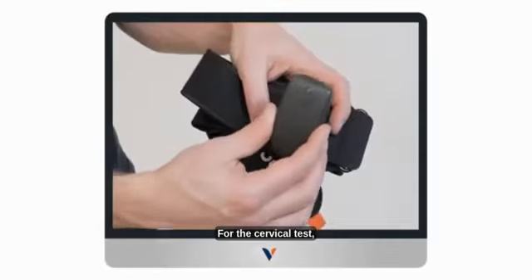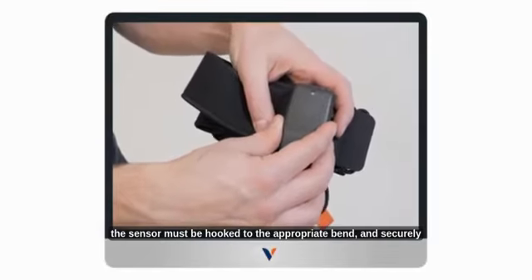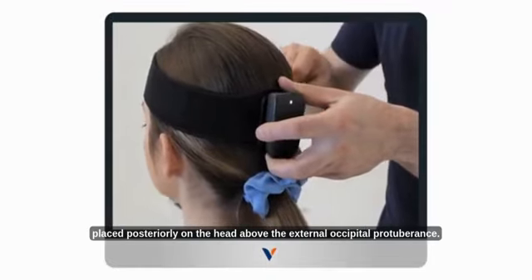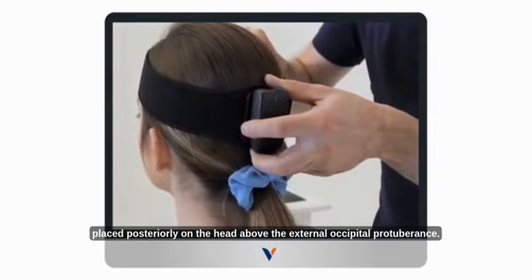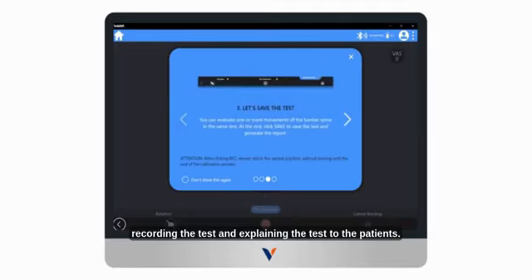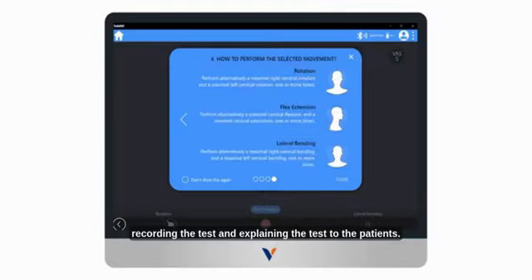For the cervical test, the sensor must be hooked to the appropriate band, securely placed posteriorly on the head above the external occipital protuberance. The pop-ups also guide us in selecting the direction of the movement, recording the test, and explaining the test to the patient.